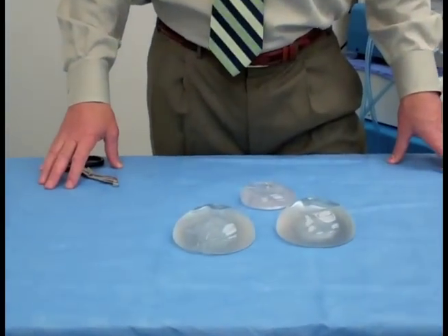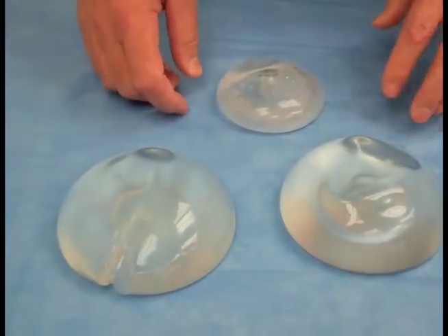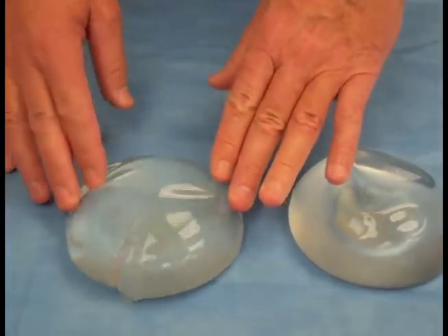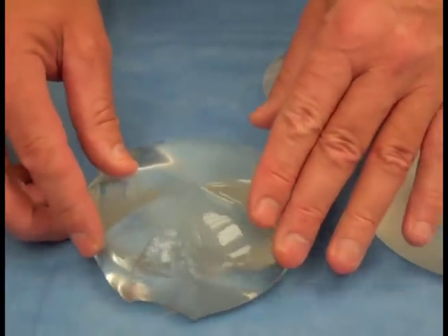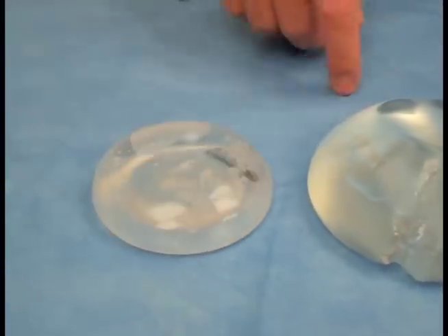If you can focus in here a little bit on these implants, that will be helpful. What I've done is I've removed these implants from a patient, so I'm going to show you what these are all about. I actually took a scissor and cut into this implant here. This is a silicone implant and this here is a saline implant.